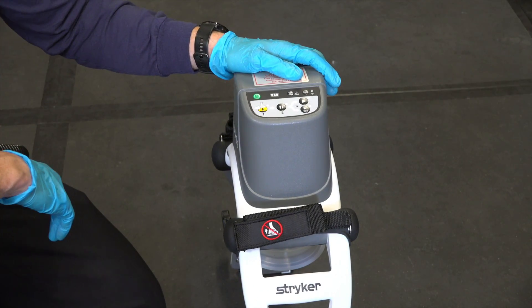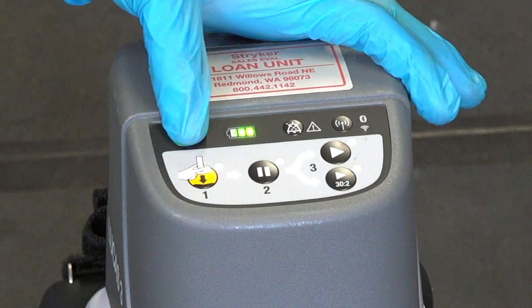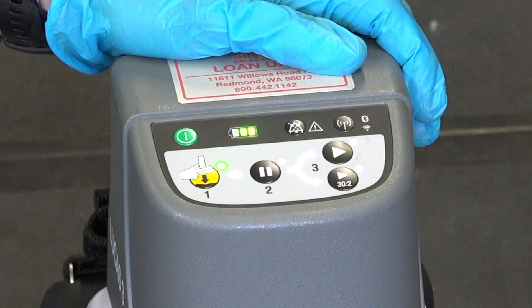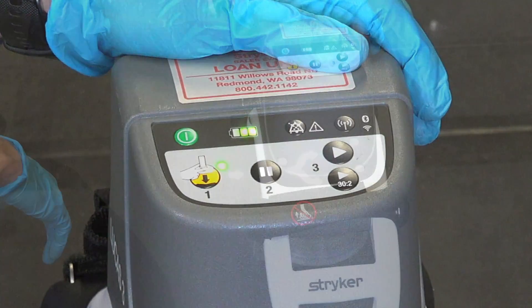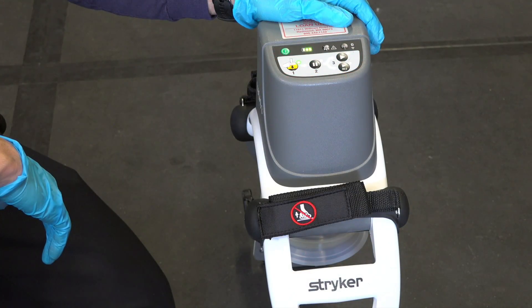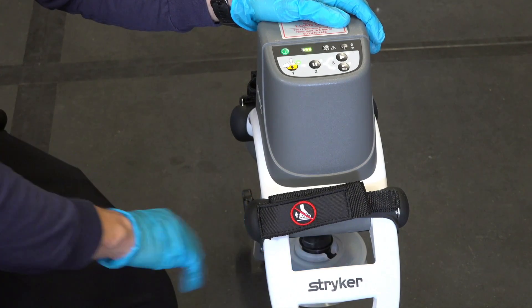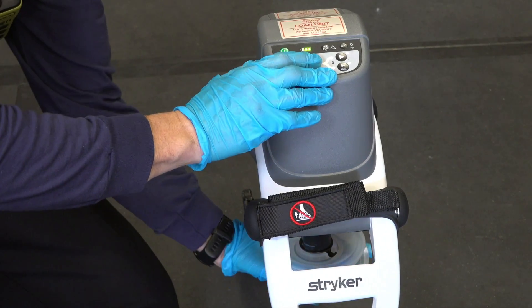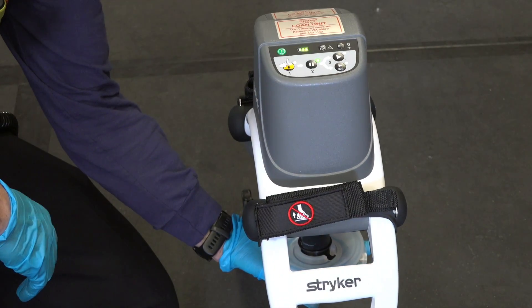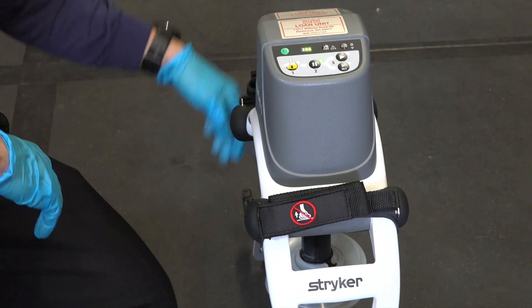Let's talk about activating and using the Lucas device. The green button on top — the activation button — will turn the device on. You'll hear four tones, and the green light will come on where the number one is. When you're ready to lower the cup, lower it down to just above the rescuer's hands, and then push button number two. That brings the device down to the chest and establishes suction. Now you're ready to start the compression part.